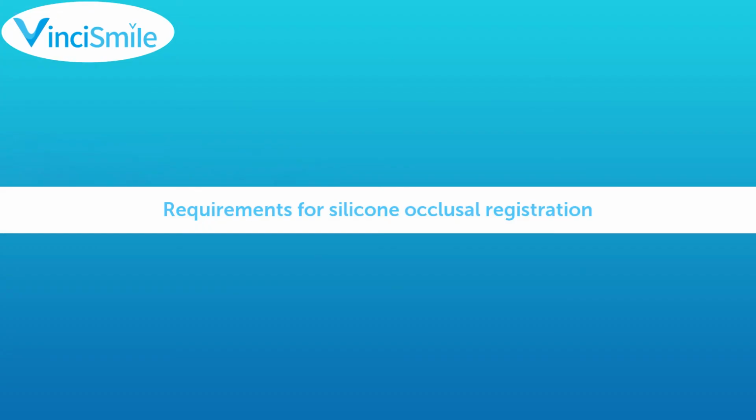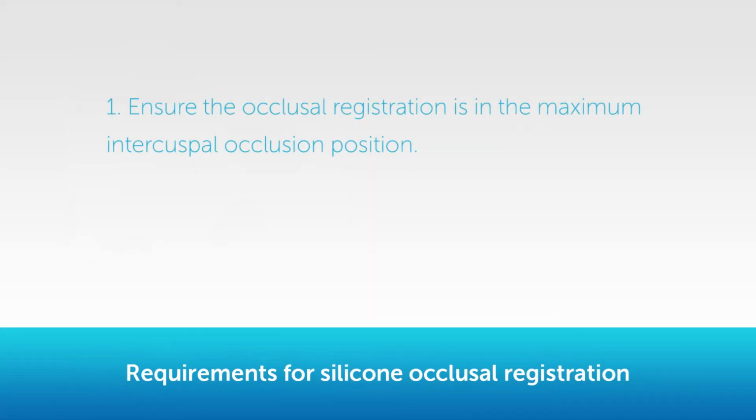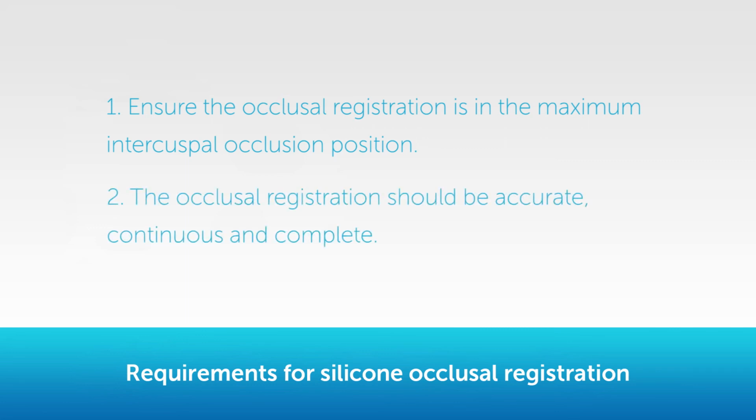Requirements for silicone occlusal registration. 1. Ensure the occlusal registration is in the maximum intercuspal occlusion position. 2. The occlusal registration should be accurate, continuous, and complete.